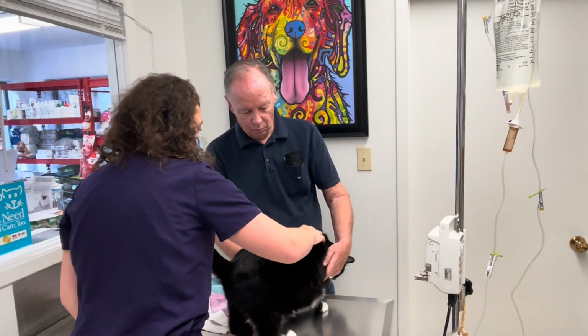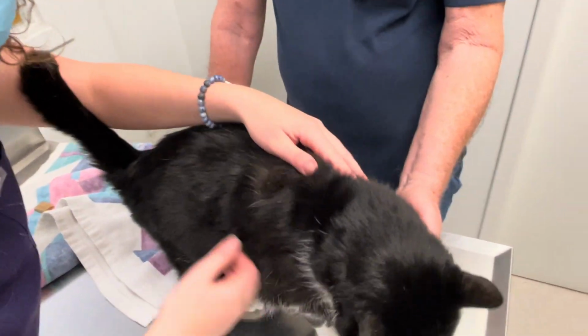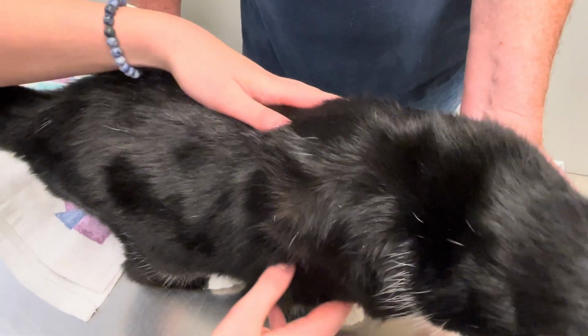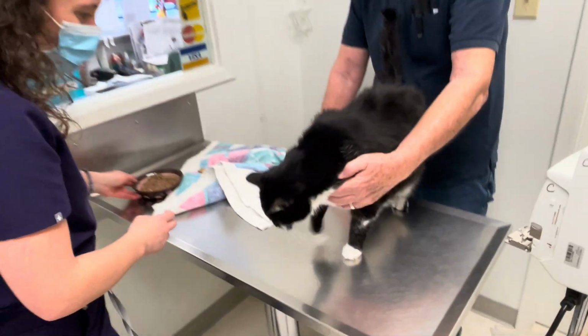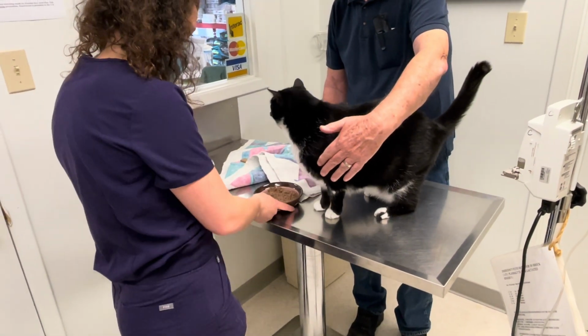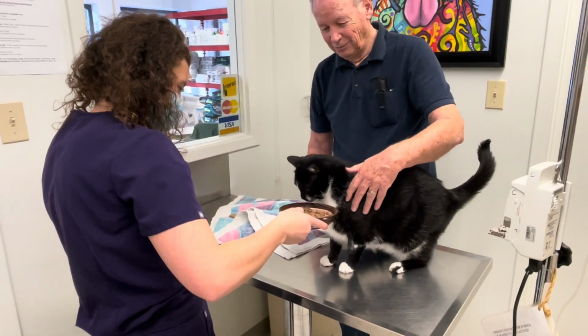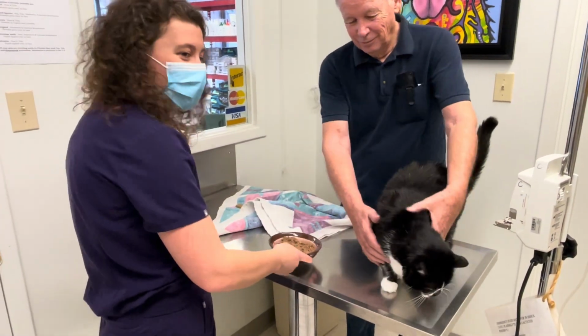And now we just have to come back and check and make sure that there's no massive amounts of water sneaking out of there, which there isn't. So we should be all set. We're gonna offer Oreo a little bit more of a snack here, see if he wants to eat a little bit more. He's interested. And we're all set.